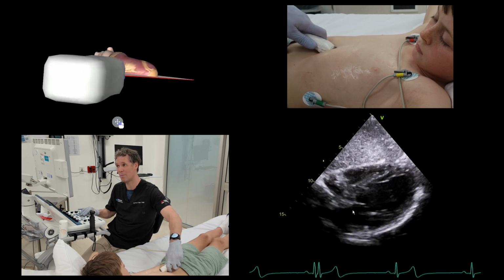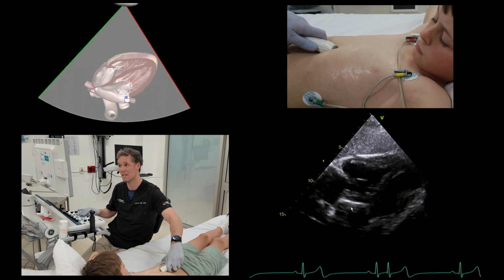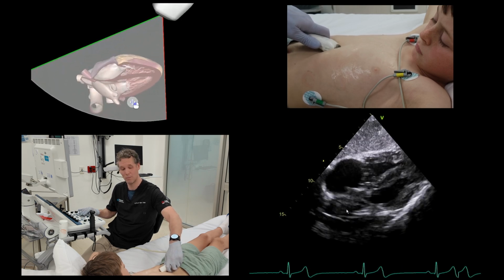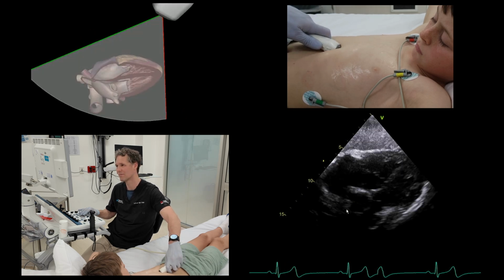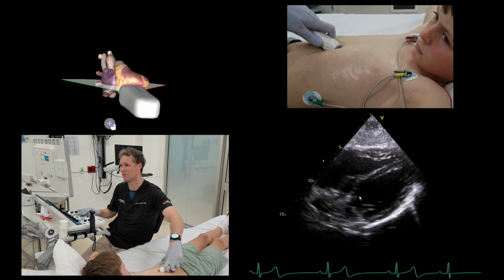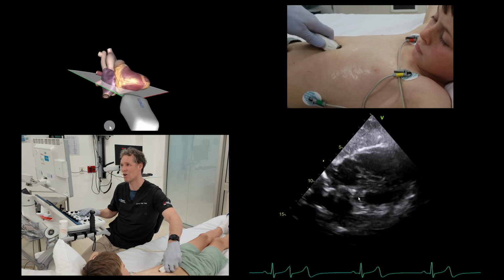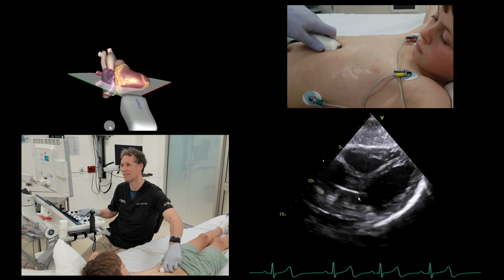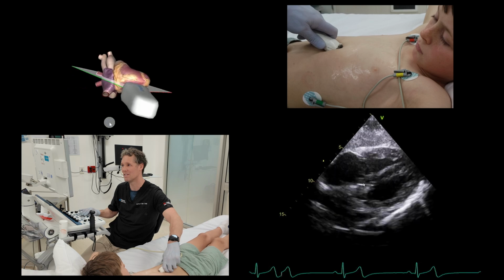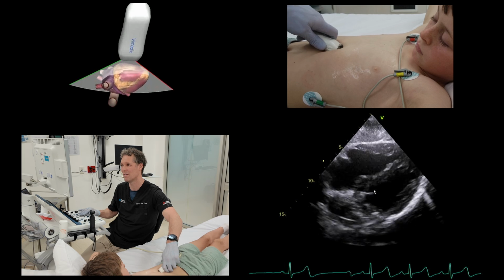So we've got to fan back. I've got to fan down till I get rid of that structure. If I look up again, there's the aortic valve, fan down, and now you can start seeing that left ventricle in a bit more clarity. I'll try to look at that left ventricle and I do little bits of rotation, one way or the other, trying to open up that left ventricle as much as we can. If I over-rotate it, it gets smaller. If I go back the other way, it gets bigger. If I see that aortic valve, I fan backwards. Make sure I don't rotate too far, and go the other way.